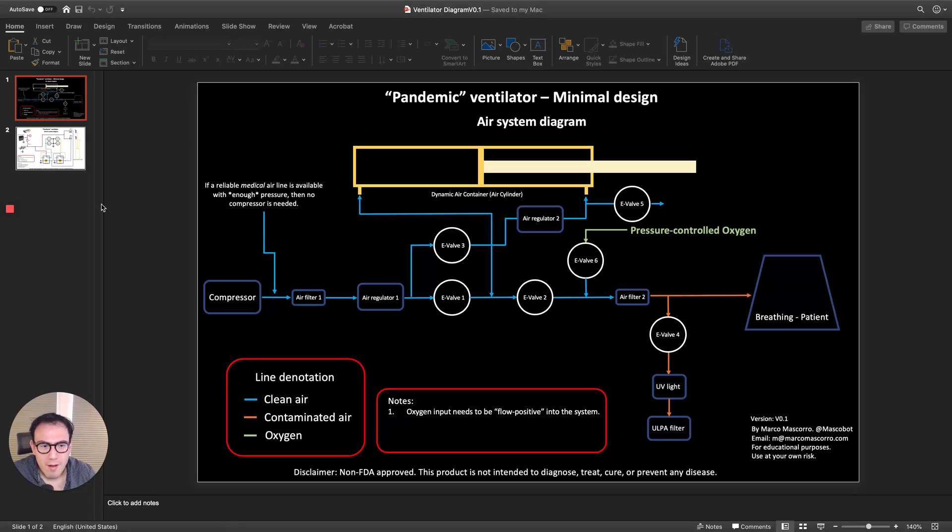First of all, I want to clarify a couple of things. This is a non-FDA approved design or ventilator, and the intention is for educational purposes — it's not meant yet to be used with a patient. I'm going to go through the design, but first there is something I want to talk about, specifically around the supply chain.